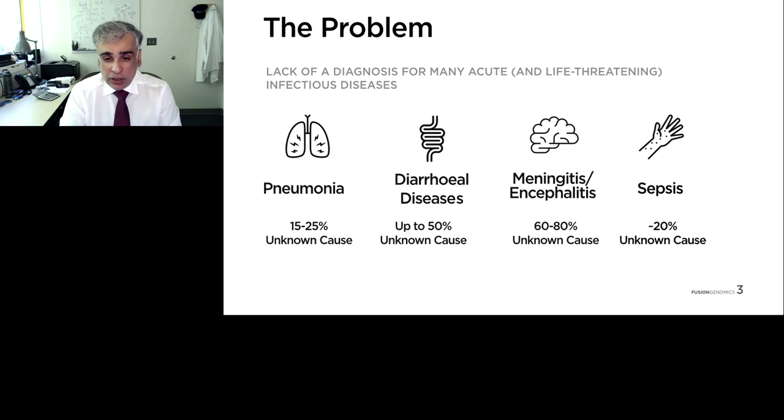Even what's not on the screen, an area where the current molecular diagnostics have made a huge leap, which is the PCR-based panels for upper respiratory syndromes.